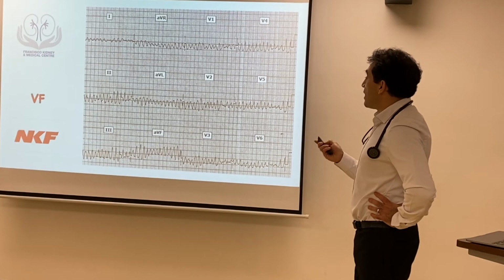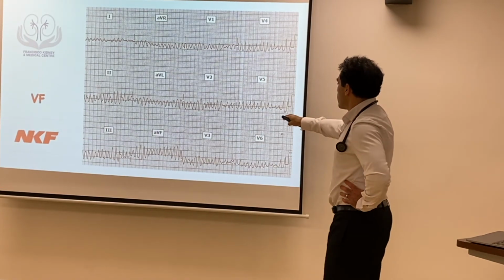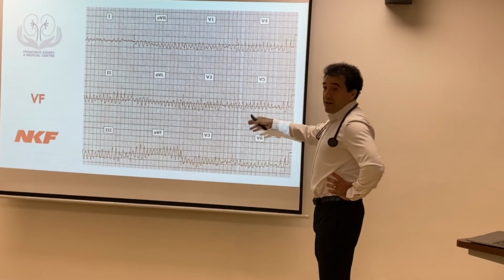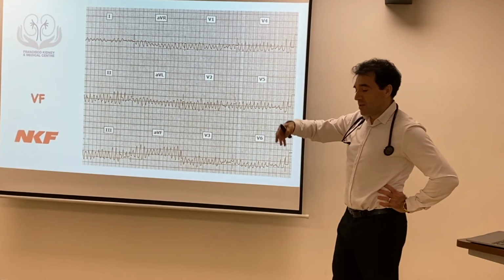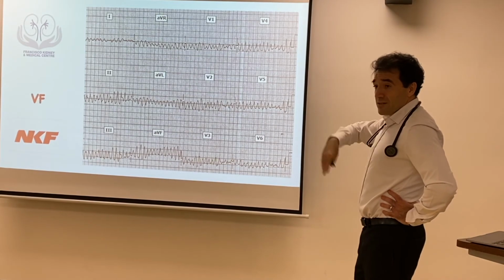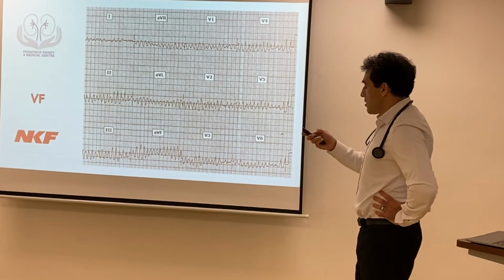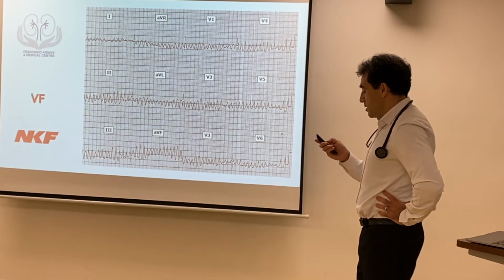Cardioversion is just trying to align with the normal QRS to catch them and try to resynchronize the rhythm. But in fibrillation, everything is very random and crazy, so it doesn't matter, and you just try to bring this to normality.